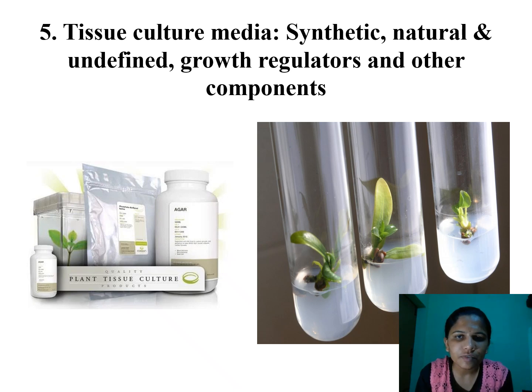Sometimes it will have only the media, like major and minor nutrients. Sometimes it will also have growth regulators. There are different medias available in synthetic media itself, which are mainly for shoot initiation as well as for root initiation. You have already practiced all these things practically, where we purchased a lot of tissue culture media preparation items from HiMedia. I think you have seen it practically also.